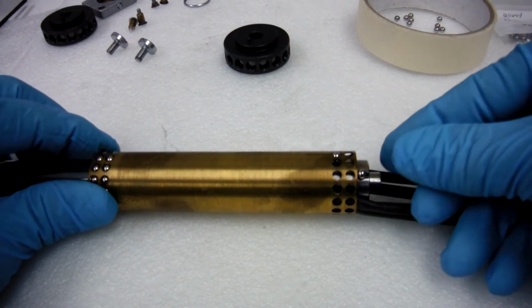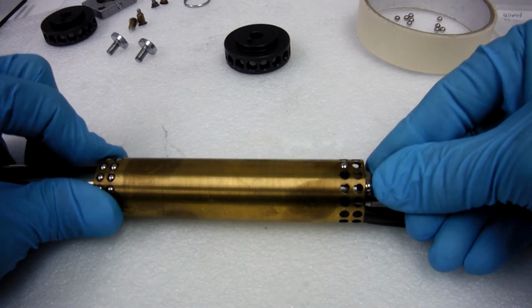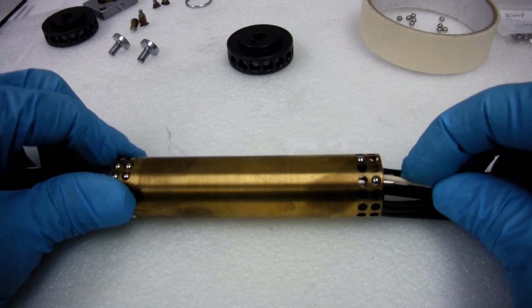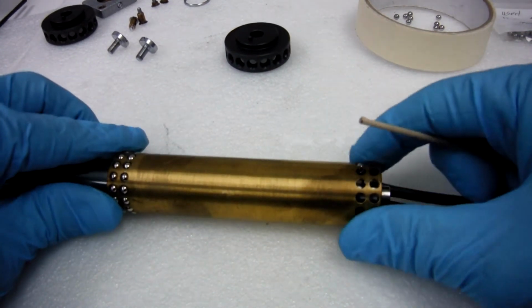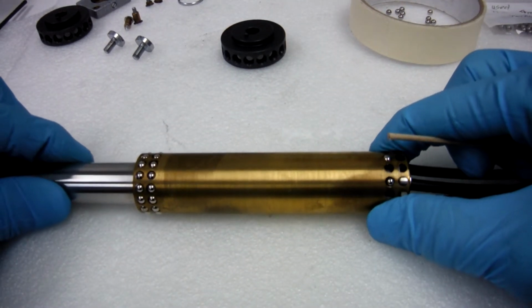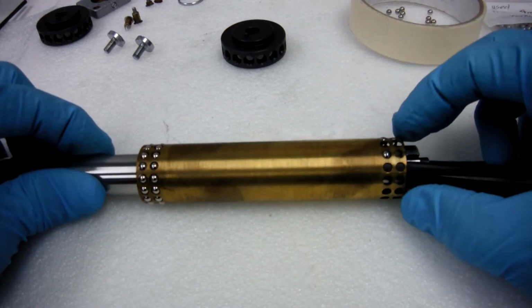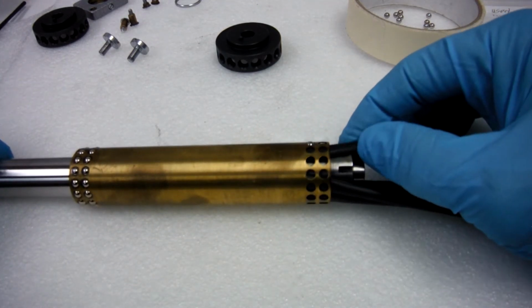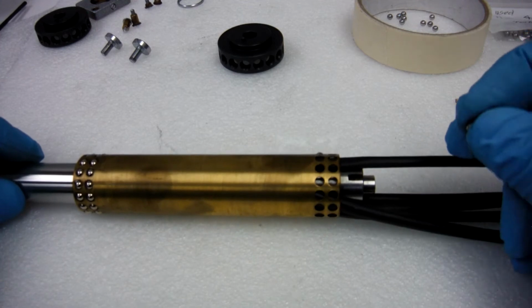Put a bearing in our track. Push our track forward to get one in the first row. Push it a little bit further to get it into our second row. Push our axle forward so we don't lose what we've got. Turn it. Skip one. Repeat the process.